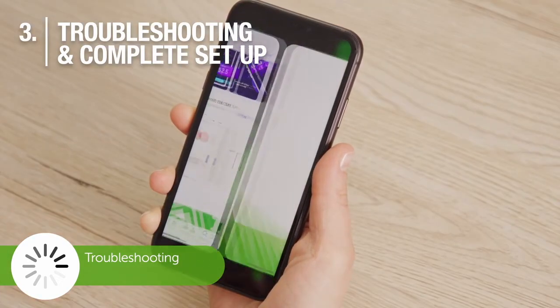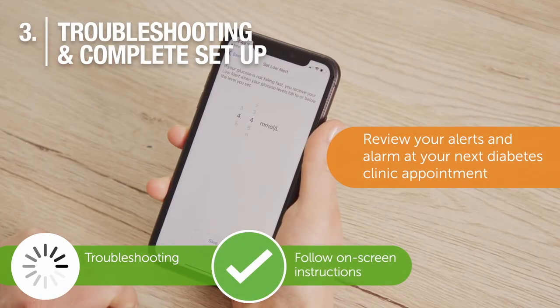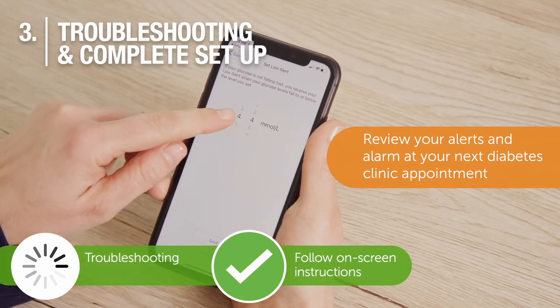If there are continued issues, please remove the G6 app and reinstall. Continue to follow the on-screen instructions to set up high and low alerts and complete setup.